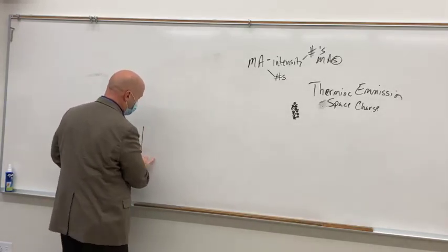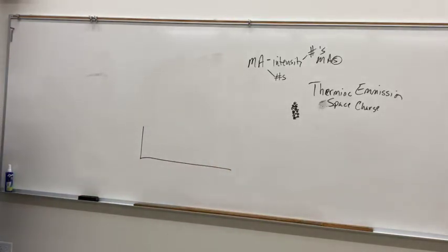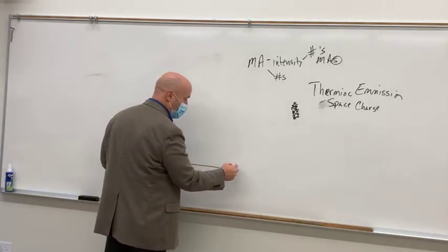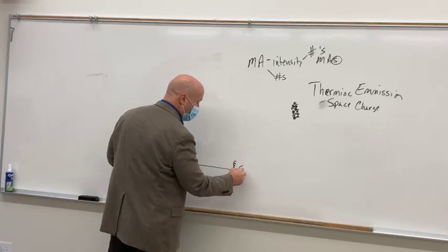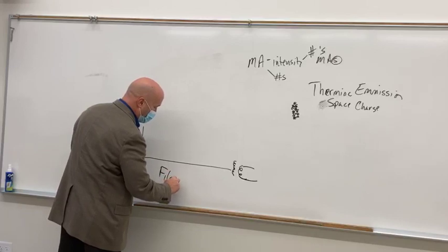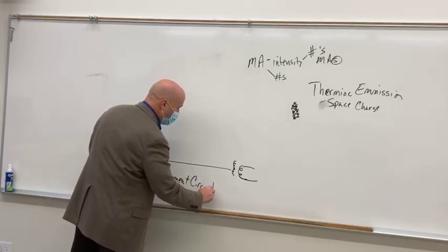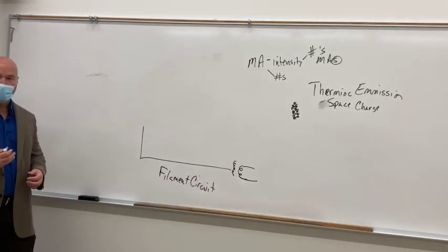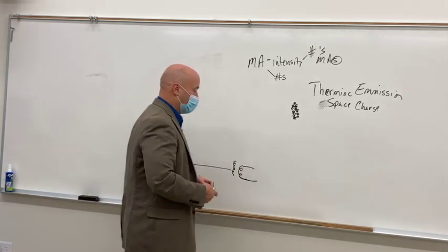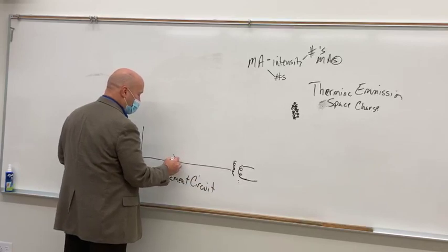Well, let's just circuit down at the bottom. What do we call it? Okay, the step-down transformer's there. So step-down transformer looks like that, right? But that is the filament circuit. Filament circuit is responsible for providing low voltage and amperage to the filament so that we can create X-rays. Before it gets to this, though, it goes through the MA selector.